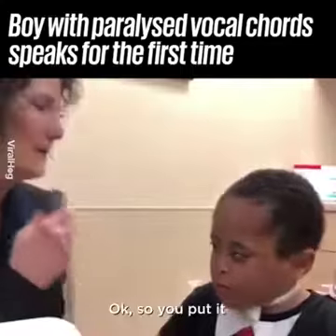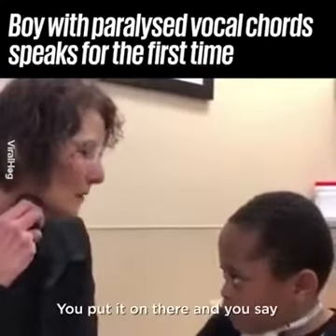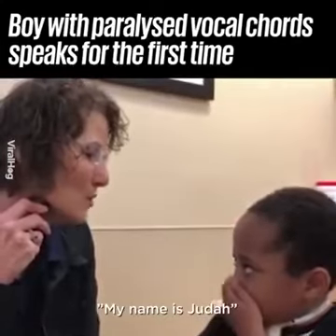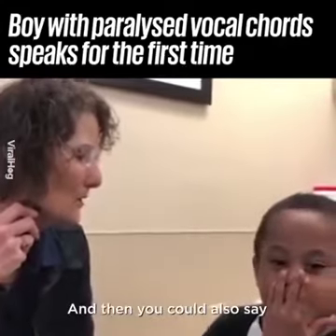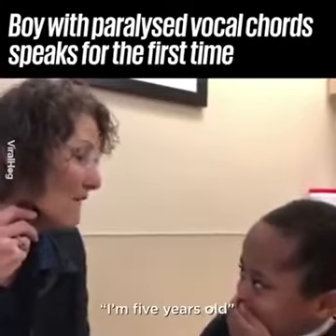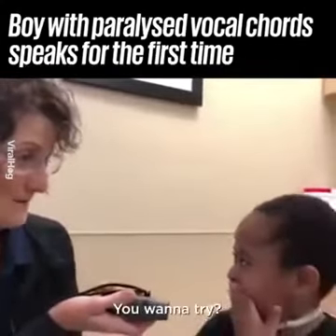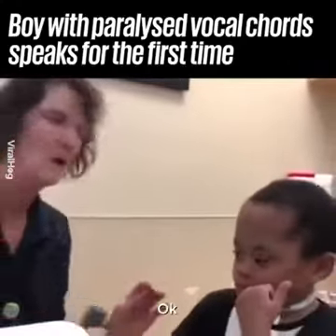You gotta find a soft spot on your neck. Put it on there and you say something. And then you could also try — do you want me to help you? Okay, that's cool.